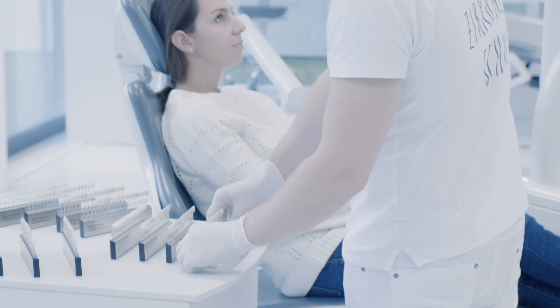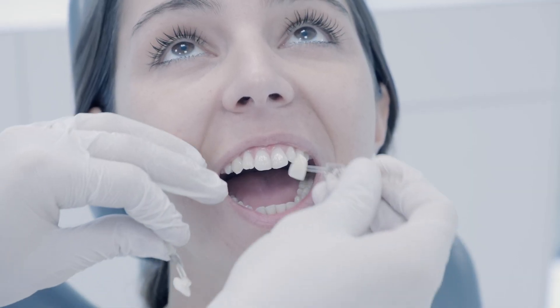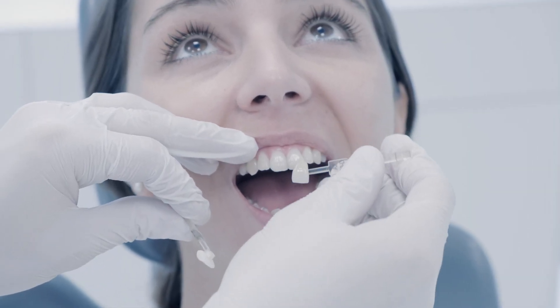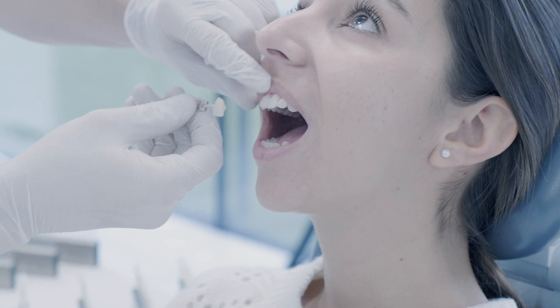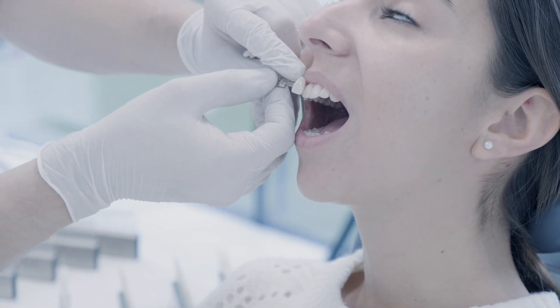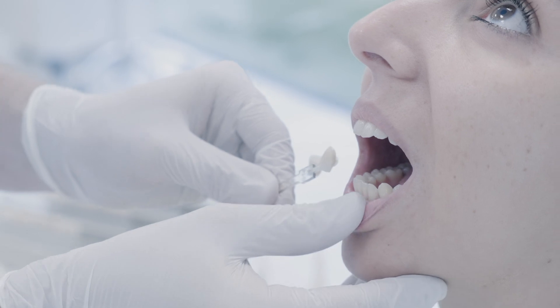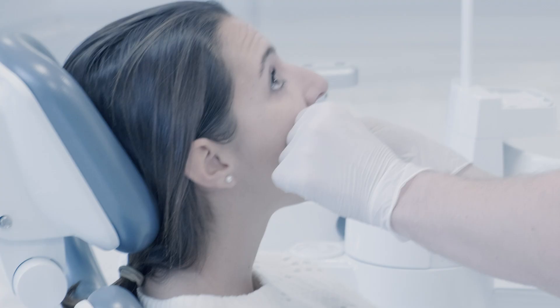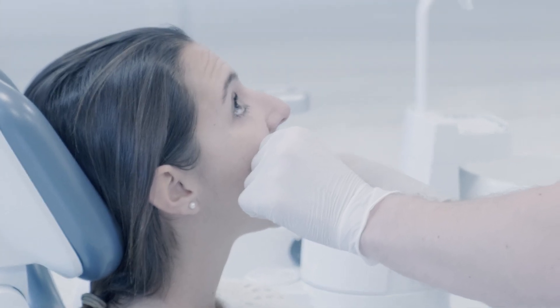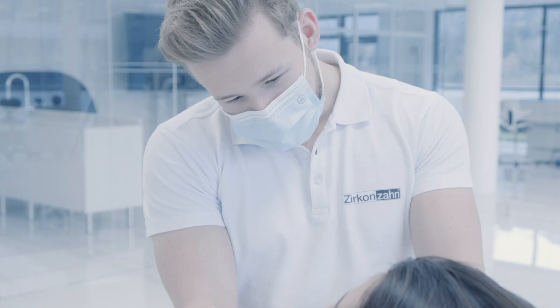Hold the shade guide in the shape of an upper incisor against the natural teeth to determine the natural tooth shade for a monolithic upper jaw structure to be fabricated in pretout dispersive zirconia, or to check the interplay with the natural residual teeth or an already fabricated zirconia lower jaw structure. The teeth surface must not be dried out, or they will appear too white.